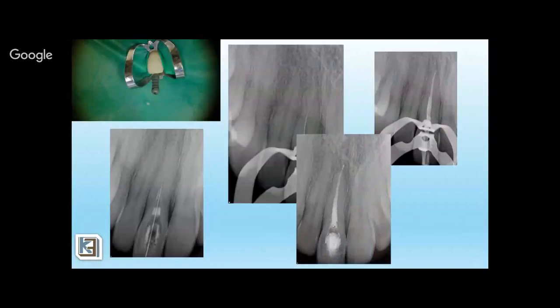Remember, I filled this all with composite, and I did not want to over prepare that central area again. There was enough damage done to the tooth. I did not want to prepare any more than that. I stayed centered on top of the canal, and everything else was filled back with composites and sealed. That's why it looks irregular and not uniform. But this is all composite in the center there.